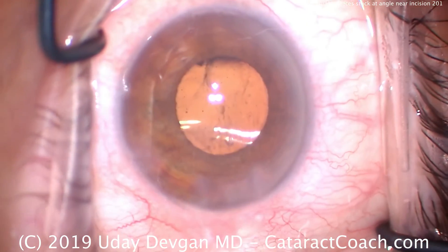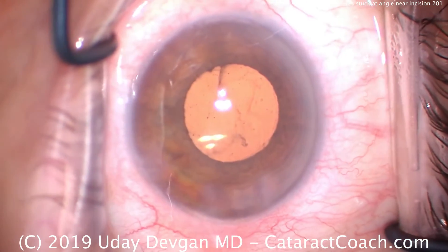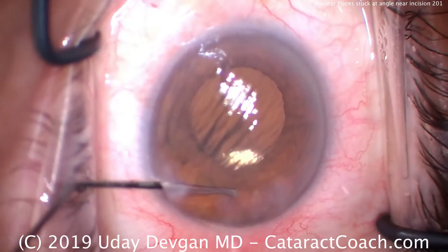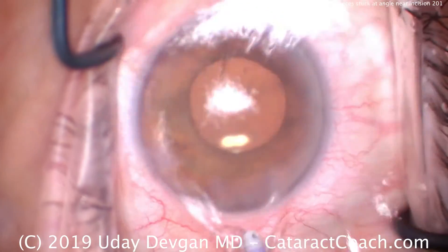Rotating the lens a little bit to ensure we have that. That looks great. Here comes the I/A probe — but first, maybe we should use the balanced salt solution again and get that little piece of nucleus stuck in that angle near the incision. There it is.